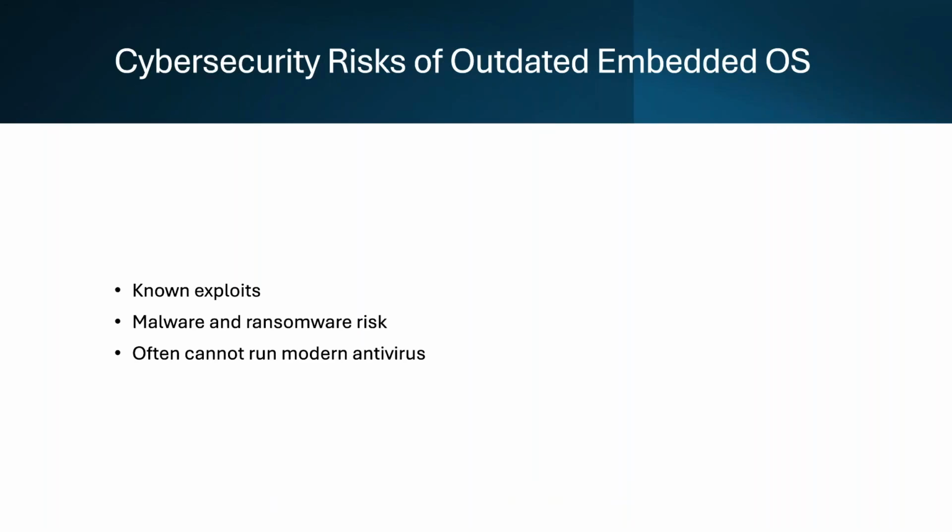Finally, ensuring service interventions don't introduce further risk is crucial. When you connect a laptop to a device for calibration or maintenance, you could inadvertently introduce malware. Using dedicated secured service tools and following proper protocols protects both the device and the network.